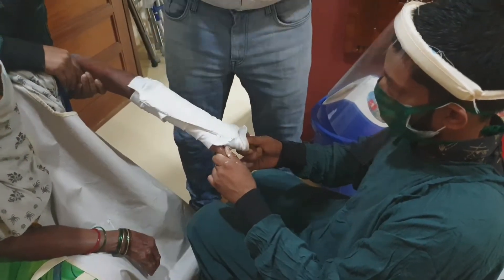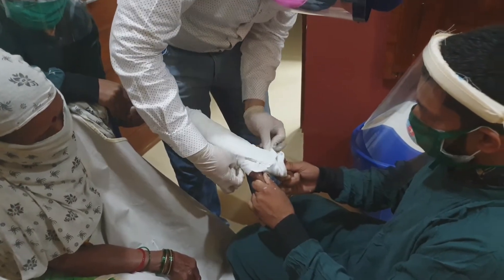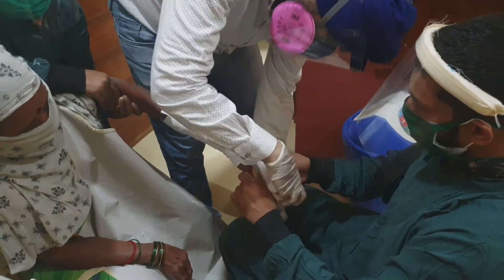Recently, some articles have suggested not to give ulnar deviation — it is a personal preference. After reduction, you can either give a slab or a cast depending on the swelling.